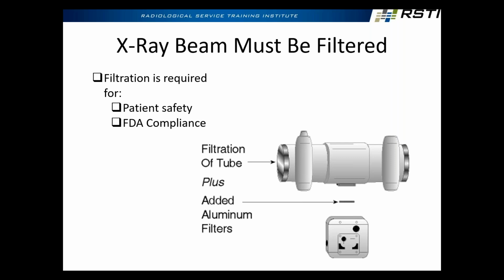All right. So the other part of this is aluminum. Aluminum, atomic number 13. Now that's the atomic number of an element. That's the number of protons in a nucleus. In diagnostic imaging, it's also referred to as its Z. When we talk about biological tissues, we refer to their Z effective. So adipose or fat has a Z effective of 5.92, which puts it just below carbon at 6, which makes sense, carbon-based life forms, right?